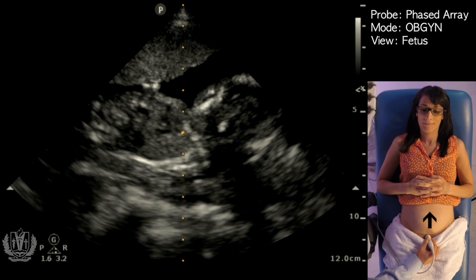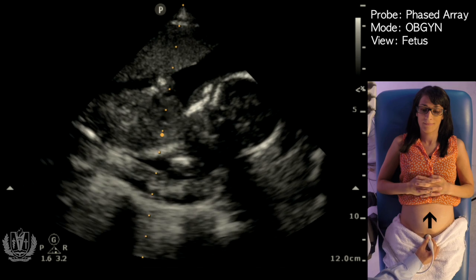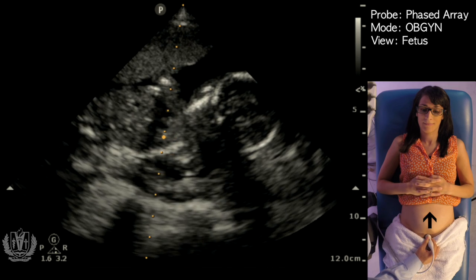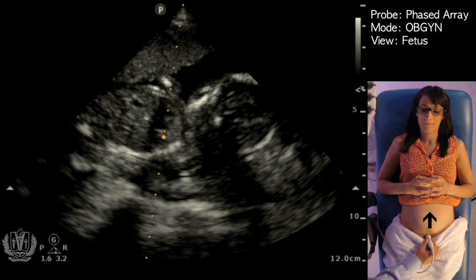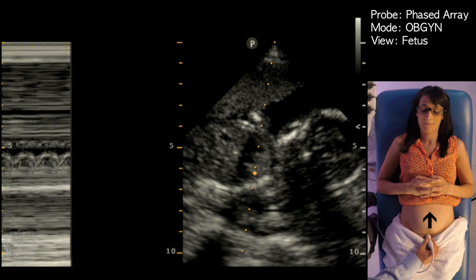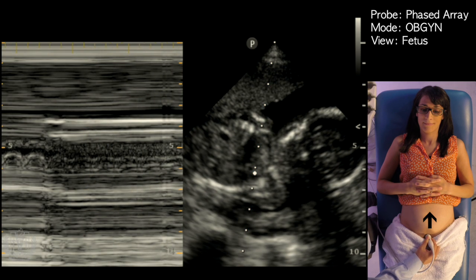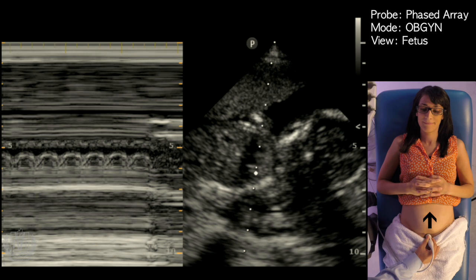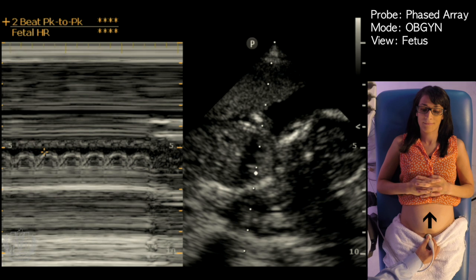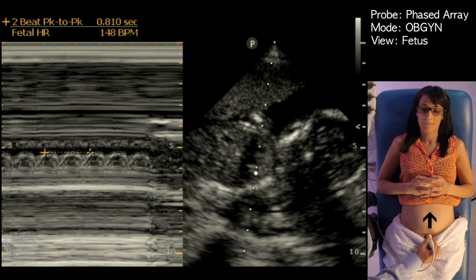We're going to put on M-mode and place it across any of the heart chambers. Activating M-mode, you can see the fetal heart motion on the screen. Depending on your ultrasound machine, you can calculate the fetal heart rate using the preset functions. Here we go from one beat to the second beat, and you can see the fetal heart rate is approximately 150 beats per minute.